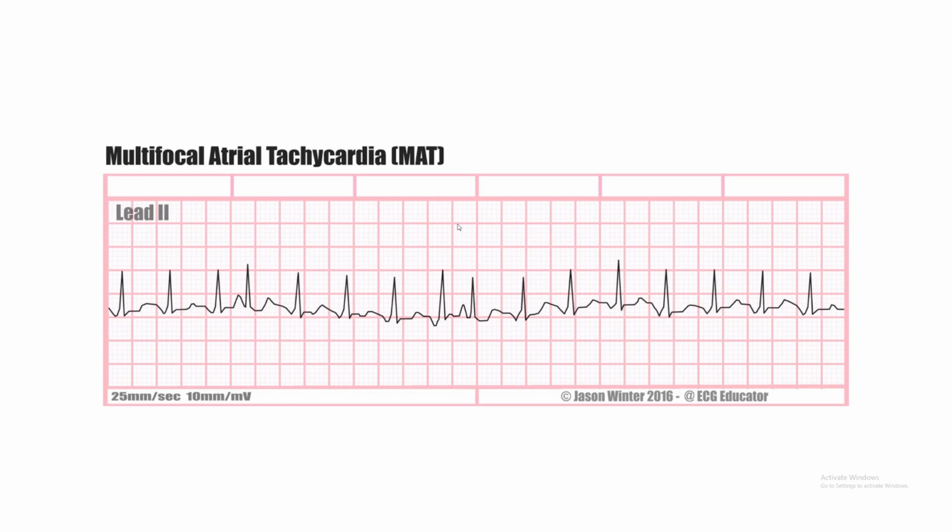This is going to be treated just like supraventricular tachycardia if the rate is above 150, and if the patient is unstable, we treat with electricity, and that is a standard pretty much anywhere.